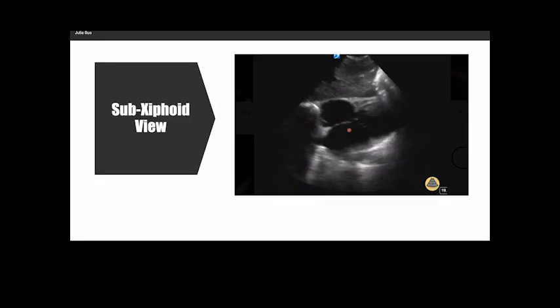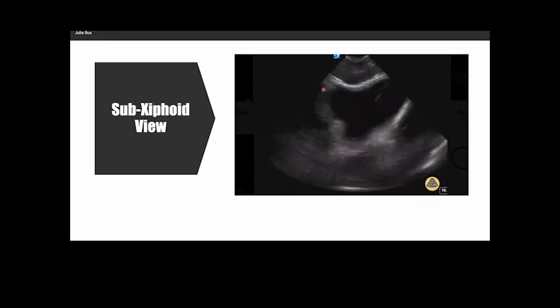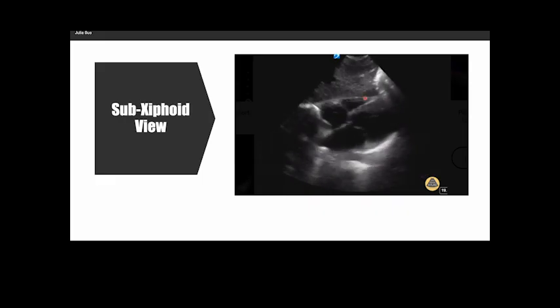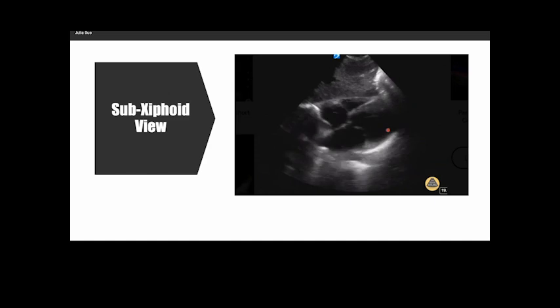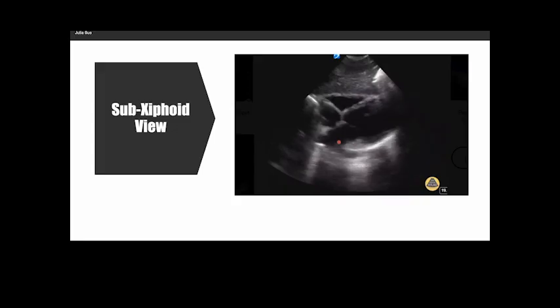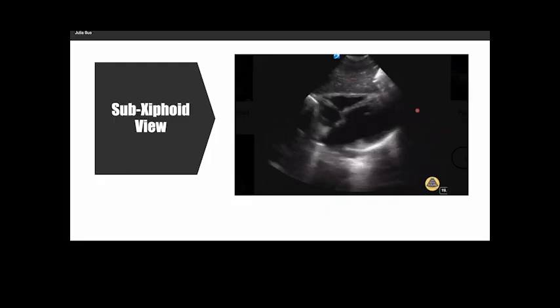All right, so here, again, the ultrasound probe is touching the skin, and you have the abdominal wall, and you have liver, right? So this is basically the same view that we did for the FAST exam. The right ventricle, which is the most anterior chamber of the heart, interventricular septum, left ventricle is here, okay, and the left atrium, and then the right atrium. Okay, I don't see any large pericardial effusion around the heart.